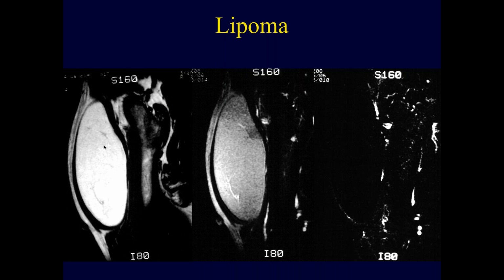But I think that MR is by far the best way to evaluate these. It's better than biopsy. The problem with biopsy is sampling error. If these kinds of lesions have sarcomas in them, they're typically not the whole lesion, and you can miss them by biopsying. So if you do surgery, you have to remove the whole thing. But yeah, you don't biopsy lipomas. You just excise them.